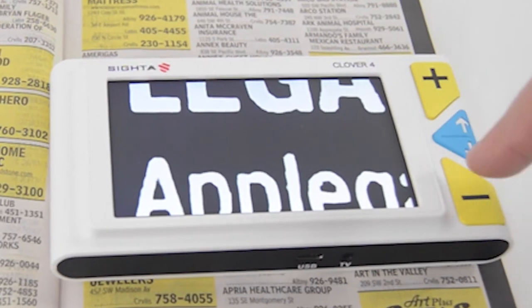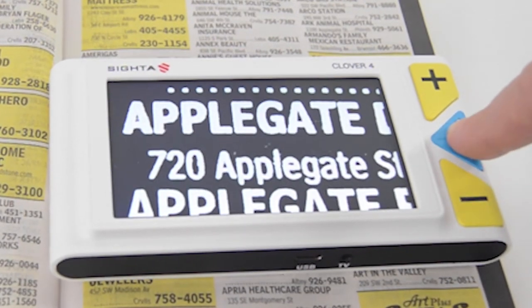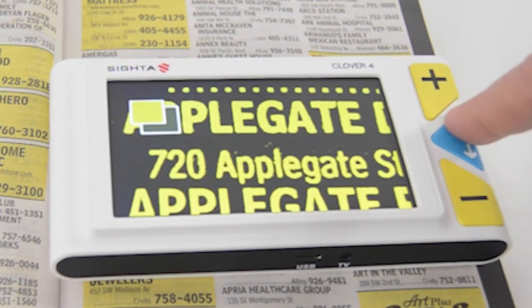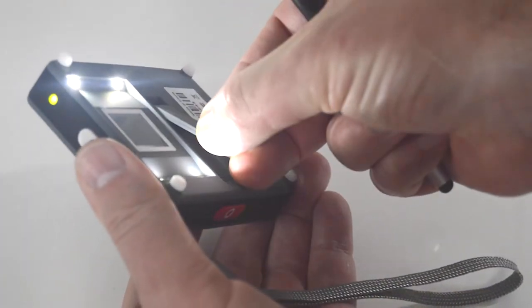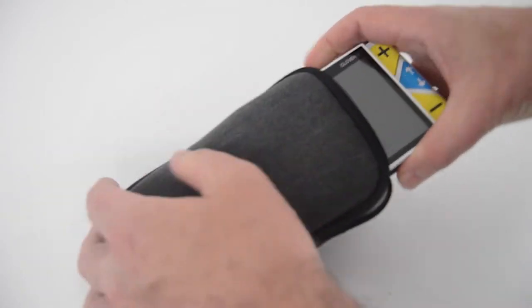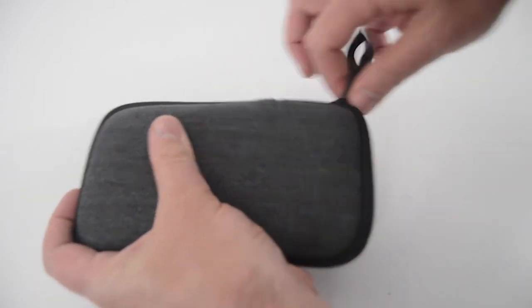All Clover video magnifiers provide crystal clear magnification, multiple contrast and color modes, as well as adjustable LED lighting. And all Clover magnifiers come with a rechargeable battery, wall charger, and a protective carry case.